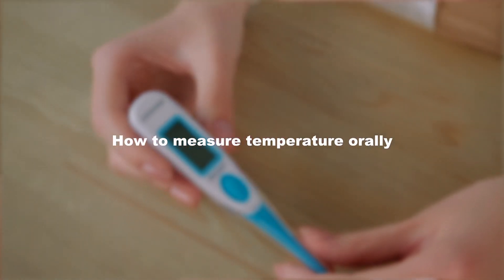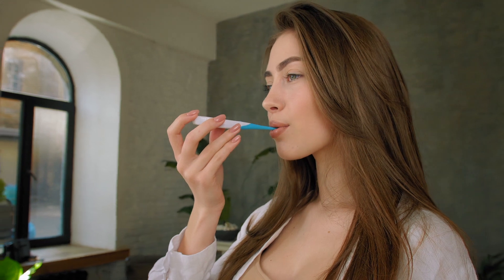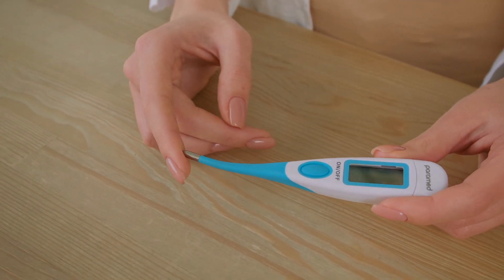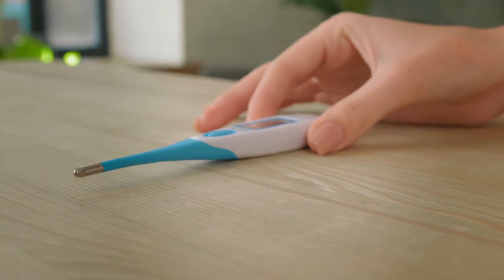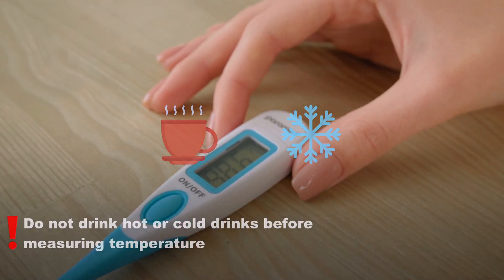How to measure temperature orally? Place the thermometer under the tongue, close your mouth, and breathe through your nose. The flexible device tip allows you to do this very easily. After the signal, you can remove the device and see the result. Do not consume cold or hot drinks before measurement.